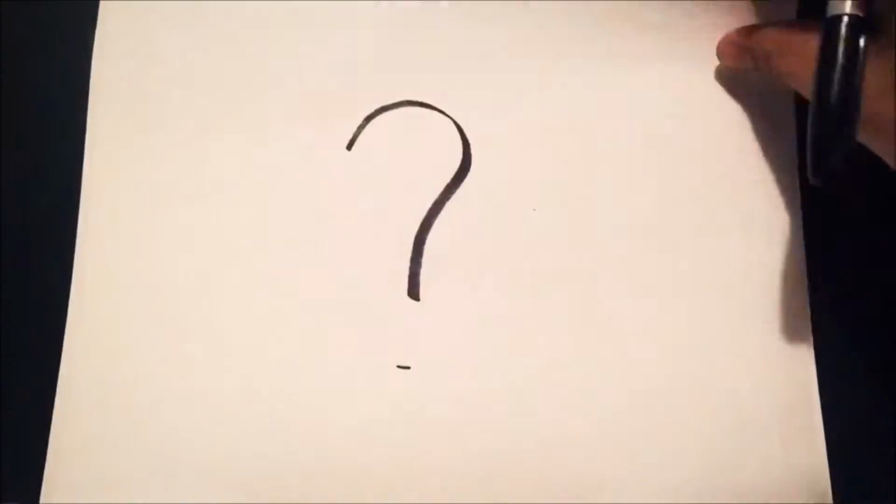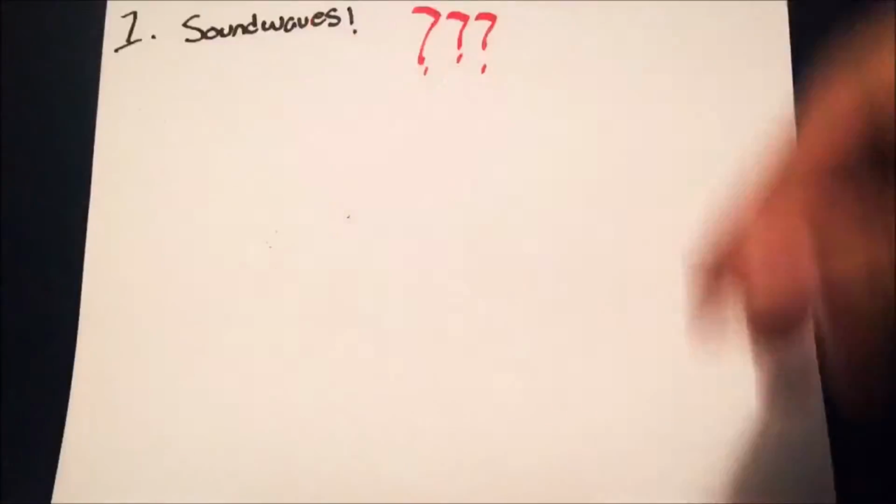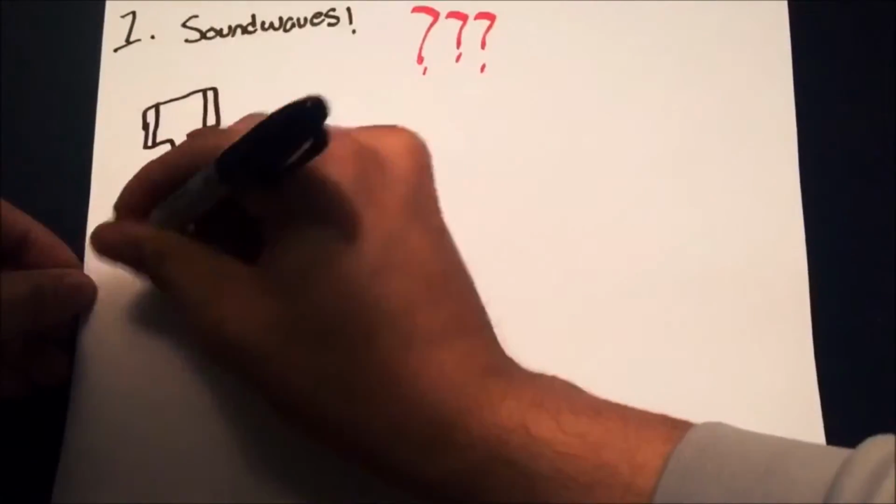Let's begin. So, what is ultrasound? The easy answer is sound waves, or acoustic mechanical vibrations. Where do they come from? How do they move? The waves are transmitted by a transducer, which is attached to an ultrasound machine.